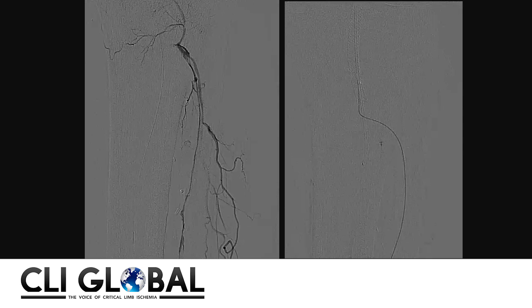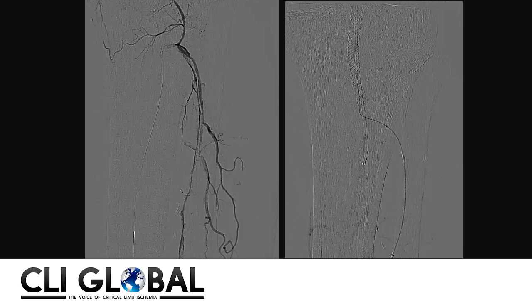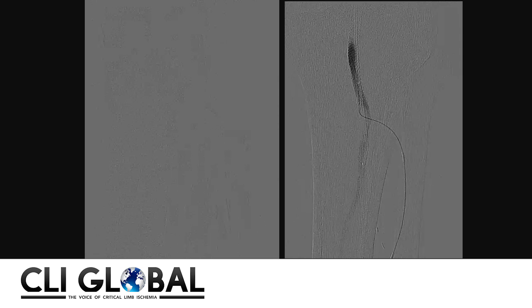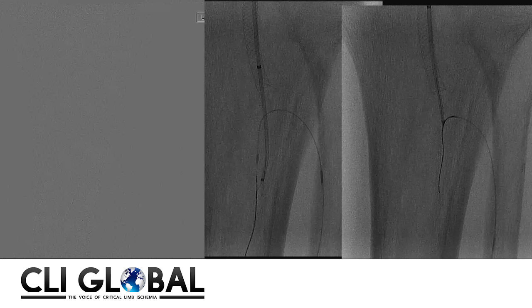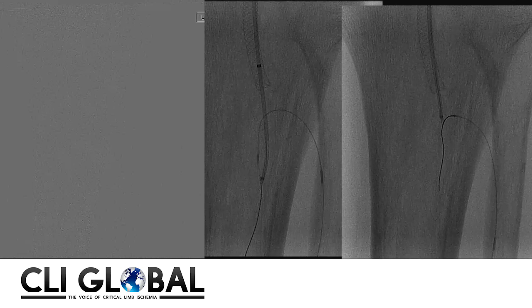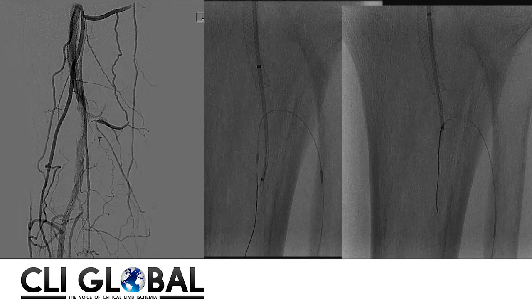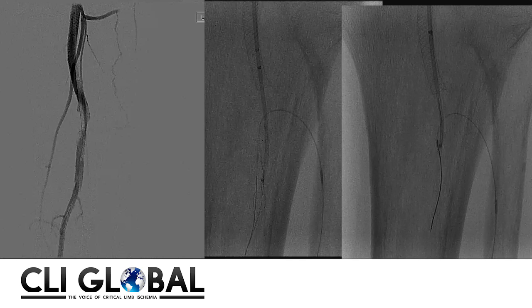To the right of the screen you can see a retrograde injection through an 018 catheter that crossed from the dorsalis pedis artery to the popliteal artery. The path the anterior tibial artery is taking is somewhat indirect, and I was concerned we were accessing the popliteal artery through a sub-intimal plane. Applying the same concept described earlier, we crossed from the anterior tibial artery to the TPT trunk.